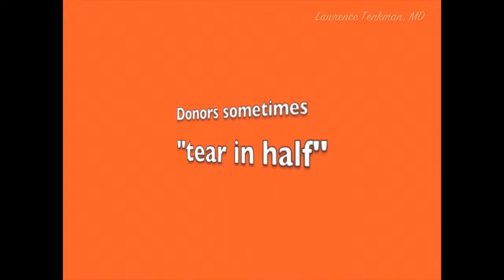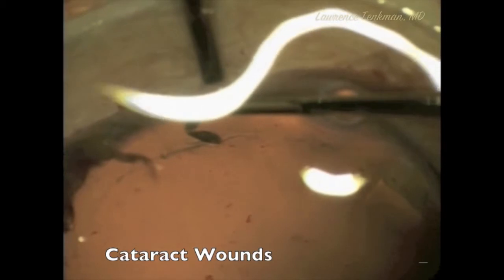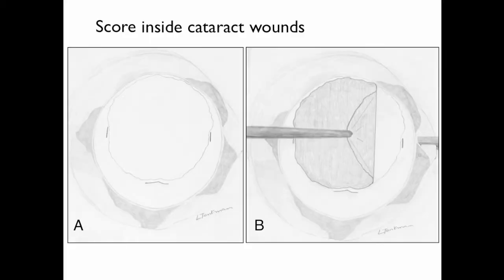So why all the trouble? Why was there tissue loss early on? Sometimes these donors tear in half. Why? Descemet's will not lift through areas of previous cataract wounds — it will tear if you try to lift it. So one solution is to score inside the cataract wounds. There is not as much room to work, but the donor can be peeled in the periphery just like any other case.